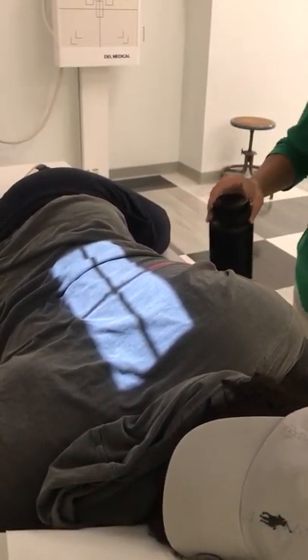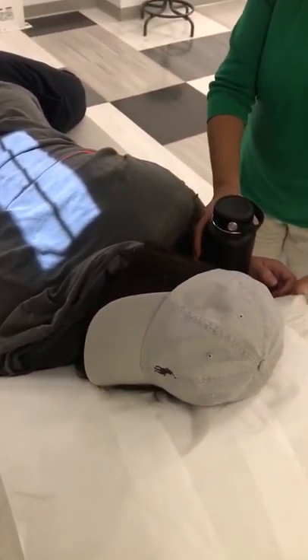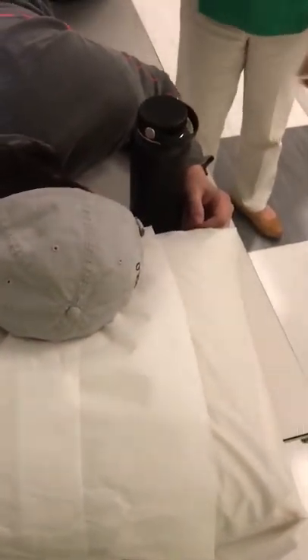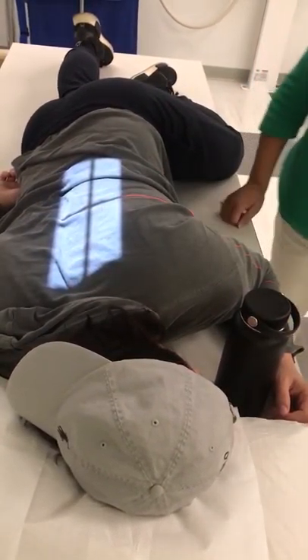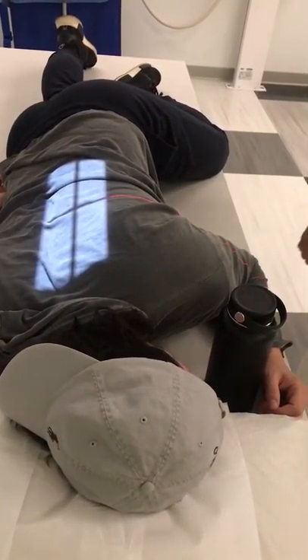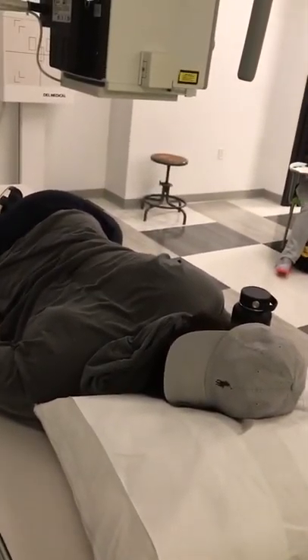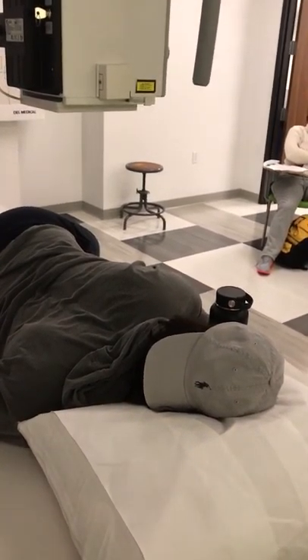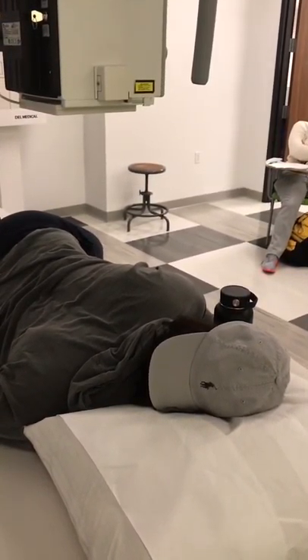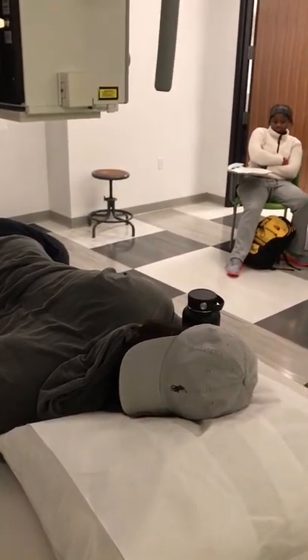Give you this yummy cup of barium again, sir. And again, I've got the corner of the pillow moved up a little bit. I want to make sure that there's room for the cup there. Okay, I'm going to give you those instructions again. Start drinking. Keep drinking. Exposure. Let me stop drinking.